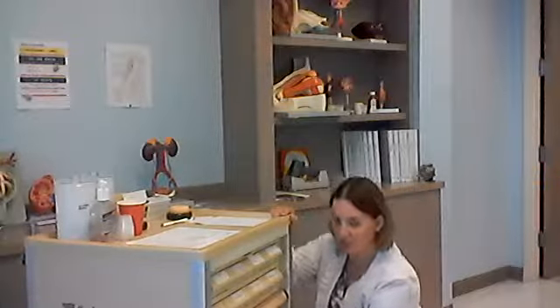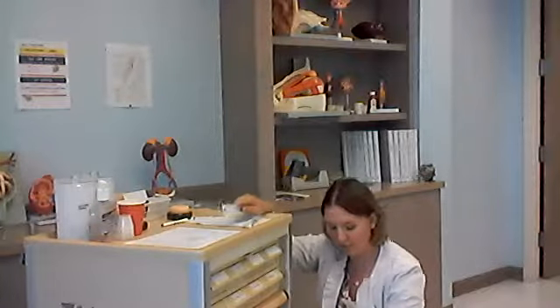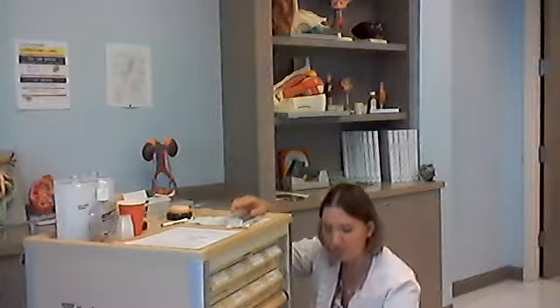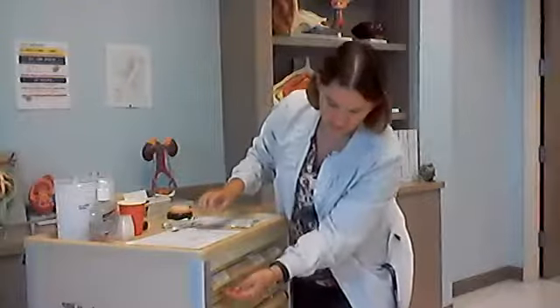Okay, now I'm going to find Mr. Walker's medication cart as well as the needles that I need. Your needles in this cart are going to be on the bottom shelf. You're going to need one for TB, intradermal, you're going to need one for intramuscular, along with another needle. And then we're going to need one for our subcutaneous injection. So 3 syringes with an extra needle. Okay? Now where's Mr. Walker?